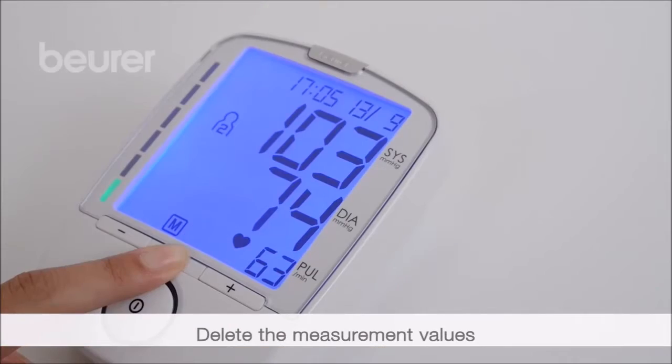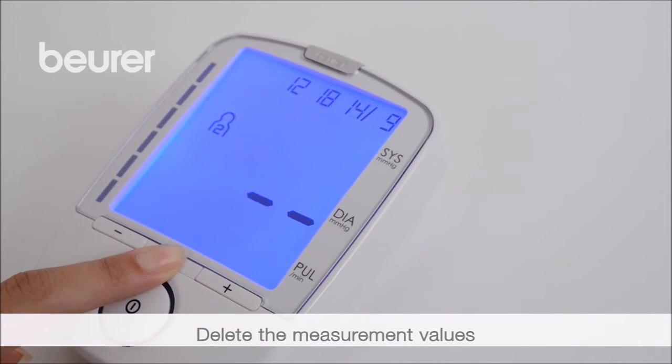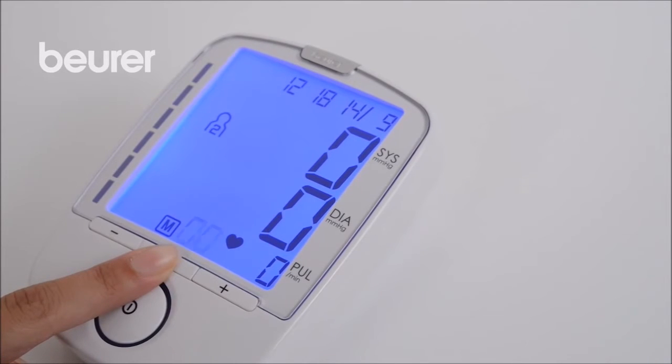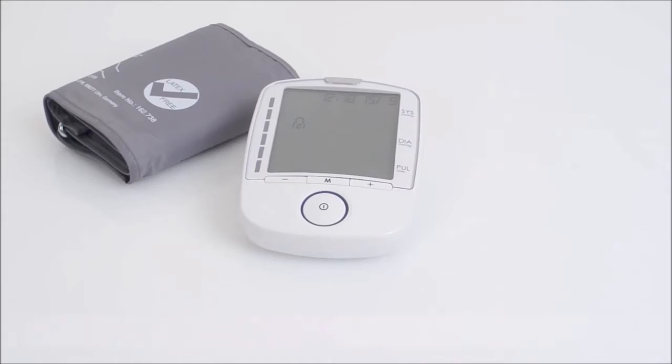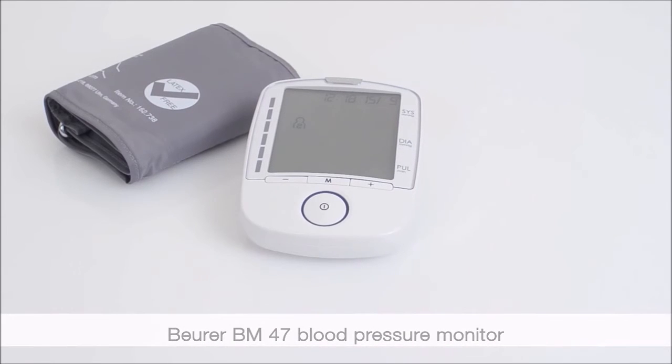To delete the values, press and hold the M button for 3 seconds. We hope you enjoy using your new BM47 blood pressure monitor from Boira. Stay healthy.